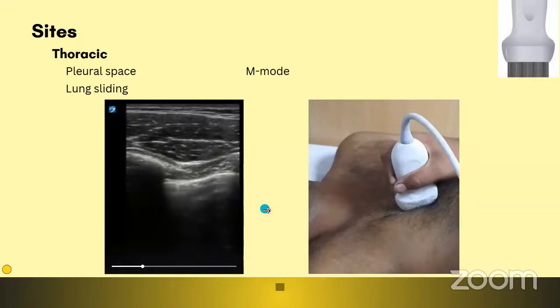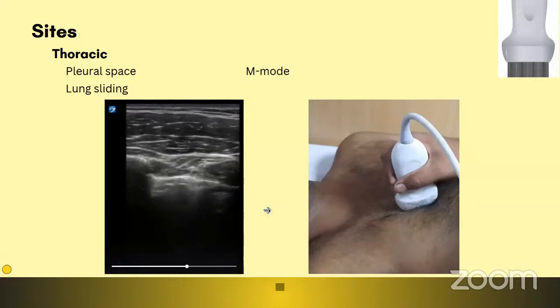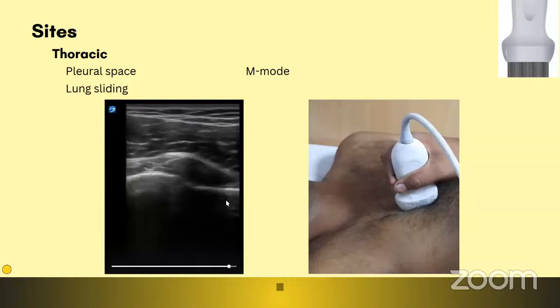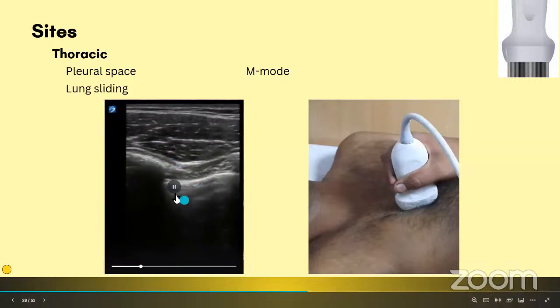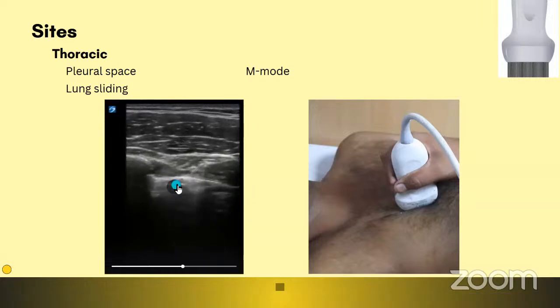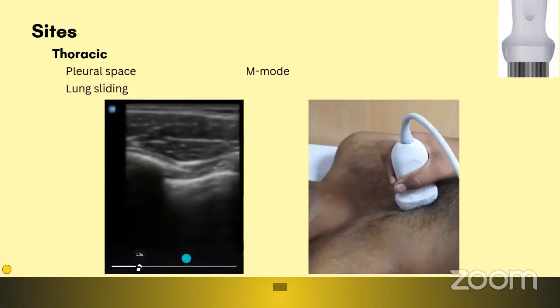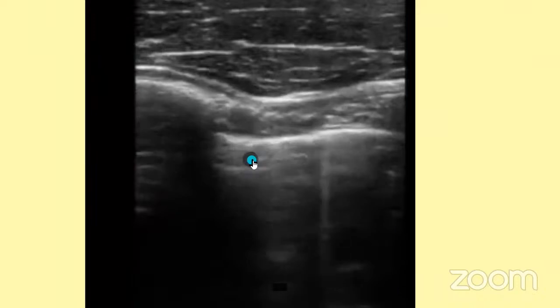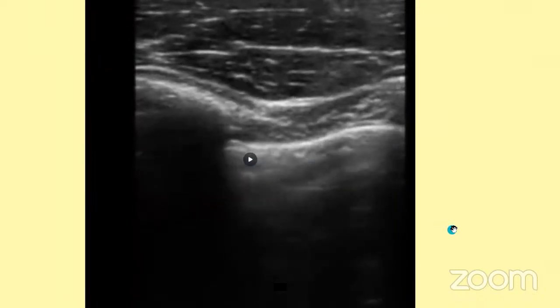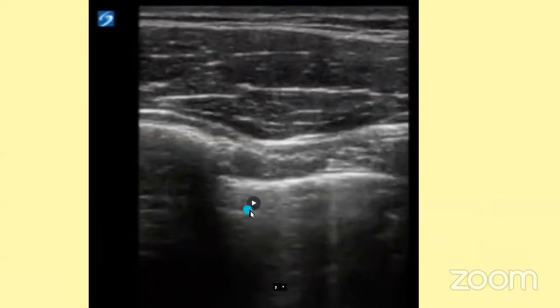Fine. Let me show you the corresponding ultrasound screen image here. That's an interesting observation here. You can see carefully, one, it is moving a lot. There is a probe movement too. However, the pleura is moving along with the respiration. Got it? So let me zoom it in and I will tell you a specific finding here. This is of low resolution because that's what the canvas is supporting here.